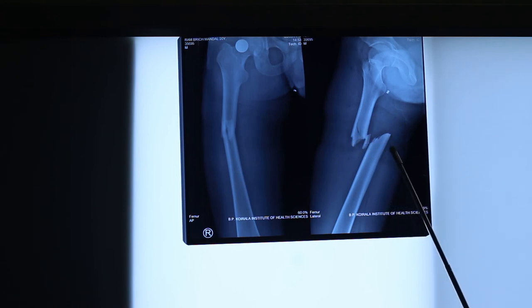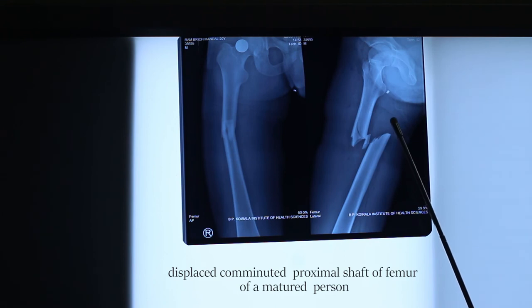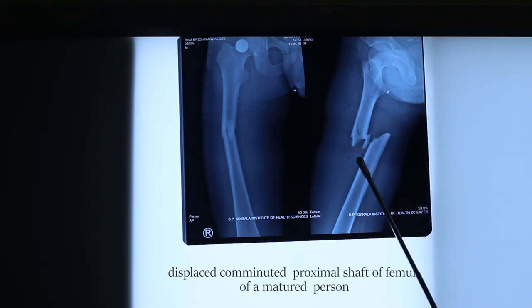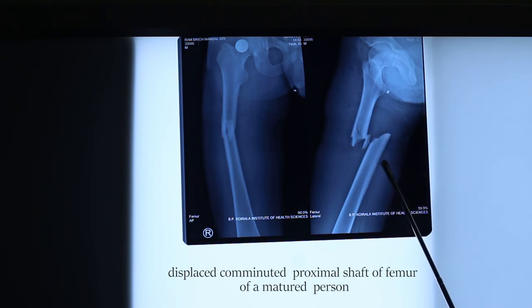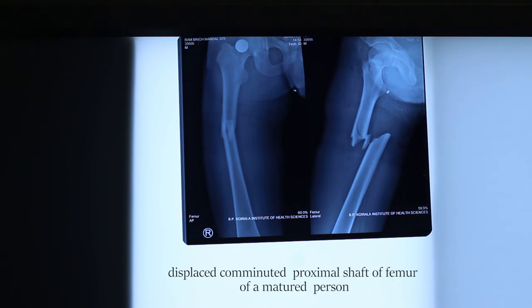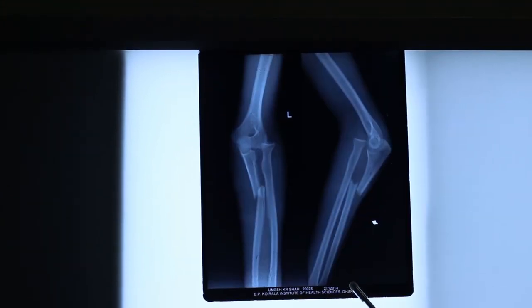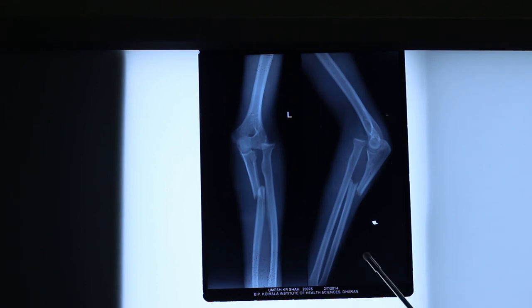You can simply say it is a displaced comminuted fracture of the proximal shaft of femur of a mature person. There are certain named fractures in orthopedics, and this is one of them.